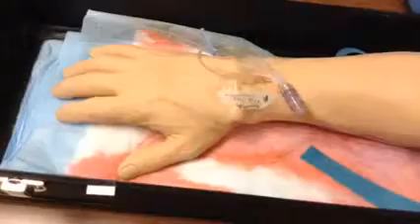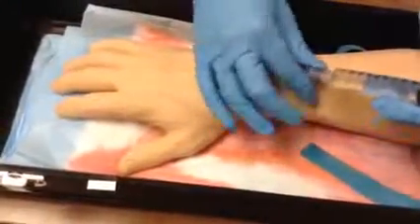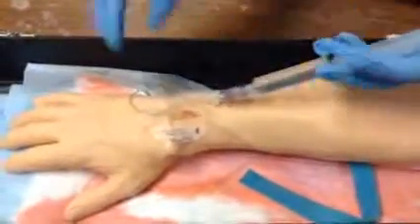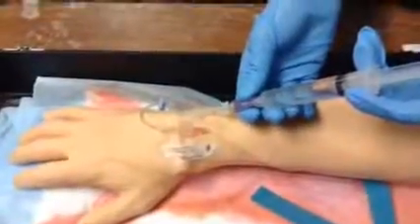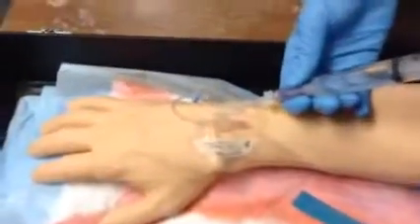Okay. So now we're going to use the ASASH method. So first thing we're going to do is aspirate. And we see blood return. Now we're going to go ahead and administer 3 milliliters of saline. Okay.